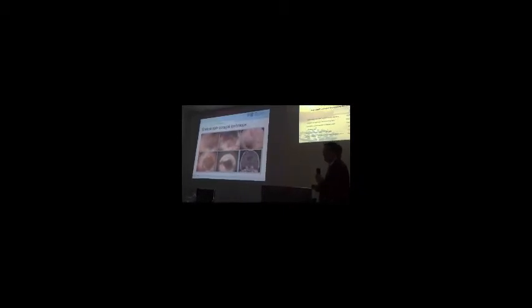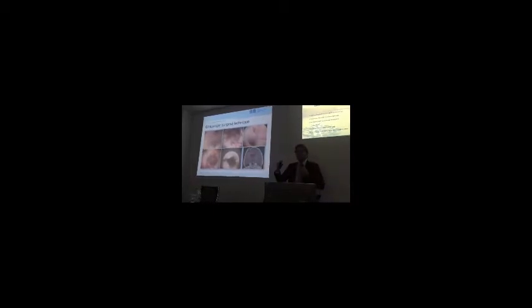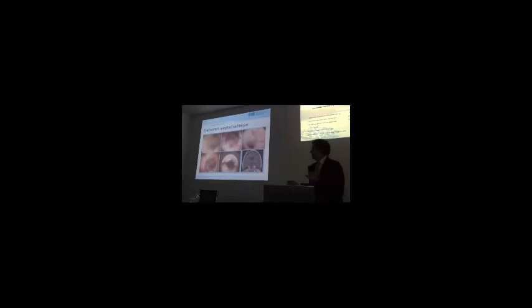Do you do a septostomy systematically or not? Septostomy, no. This is the inspection here of the contralateral foramen of Monroe. If you have 70 degrees or 30 degrees optics in, you go on the third and you see that this is the contralateral foramen of Monroe. It's wide open. There's no reason for septostomy.